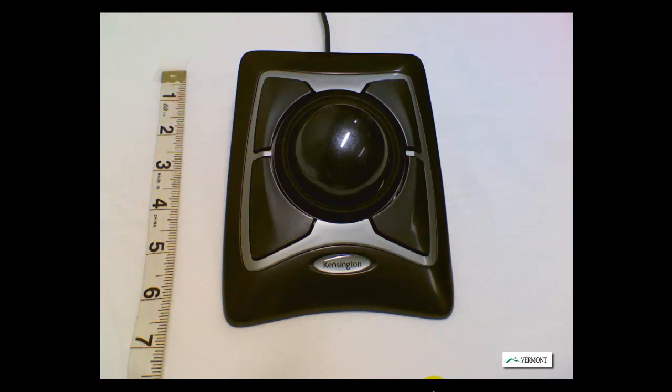Trackballs are stationary devices, meaning the person does not have to move the device. The person only needs to focus their attention moving the ball. Simply moving this ball will cause the computer arrow and/or cursor to move around the screen, similar to if you were using a regular mouse.